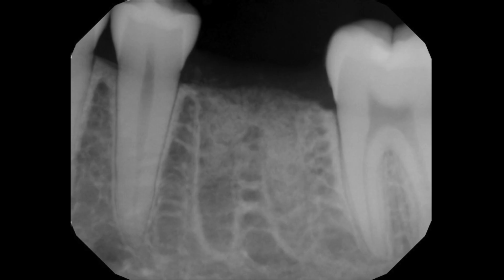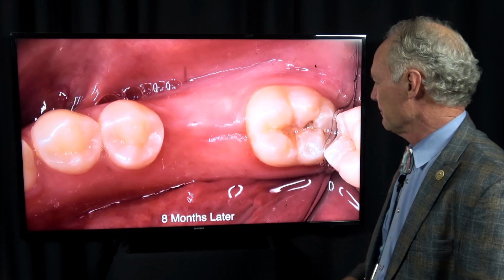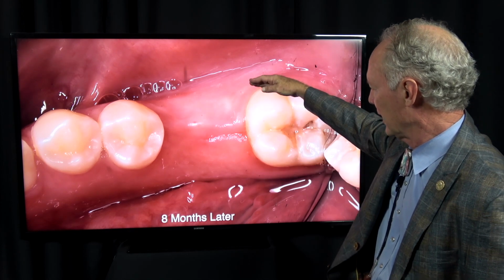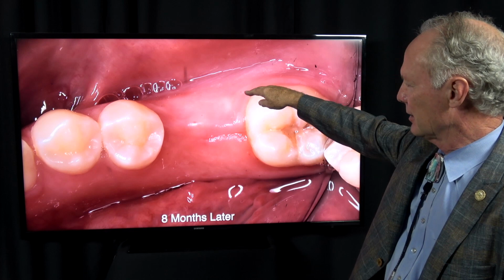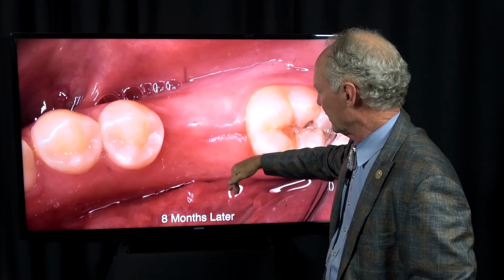There's the graft. Now this is 8 months later. You can see how the flaps have closed. It heals about 1 millimeter a day and it granulates in. But you don't have to reflect all the way down to the unattached non-keratinized gingiva and cut releasing incisions to bring that flap over.